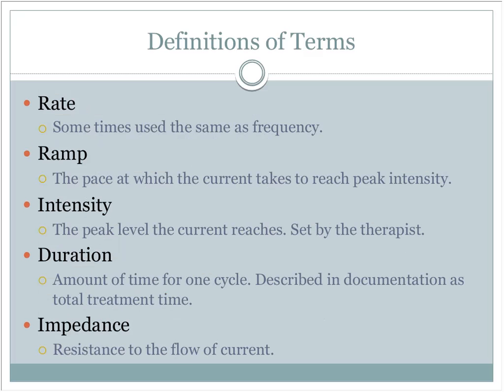The rate is sometimes used interchangeably with the frequency. Just how quickly, or how many times, does that wave start and end. So you'll see rate typically more written in the unit that you're using, the electrical stim unit that you're using, versus frequency.